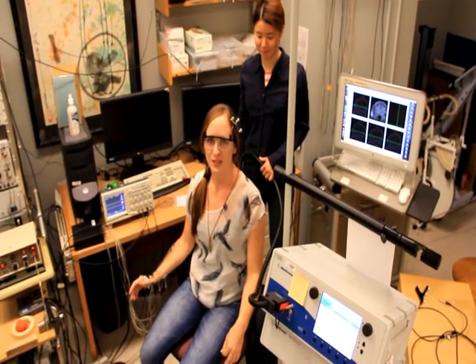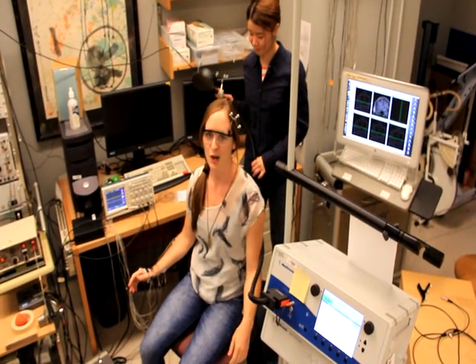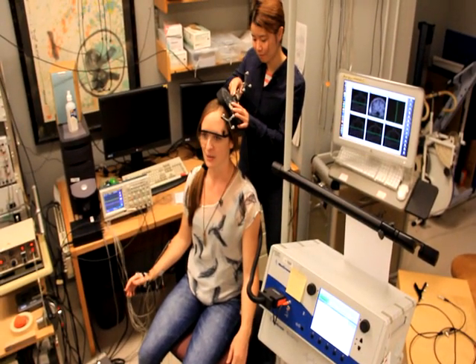First, Yoshi's going to put the magnetic coil over the area of my motor cortex that's responsible for the muscles of my hand and forearm. Once she's there, she's going to deliver a magnetic pulse.